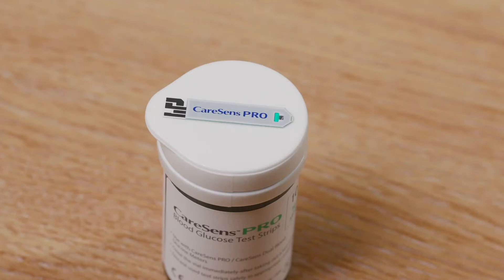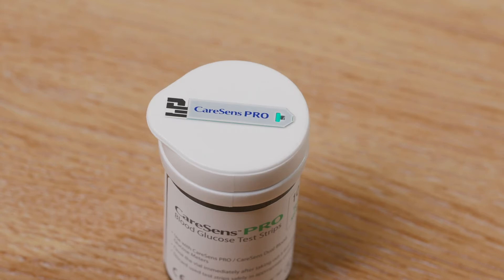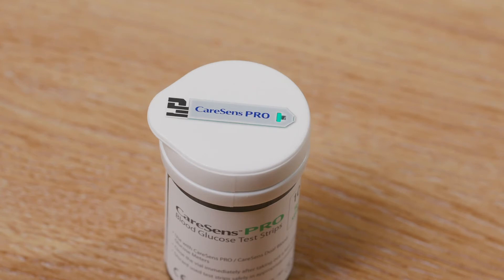You will see some black lines at one end of the strip. This is the end that is inserted into the meter. At the other end there is a small blood droplet symbol. This is where the blood should be placed for a reading.